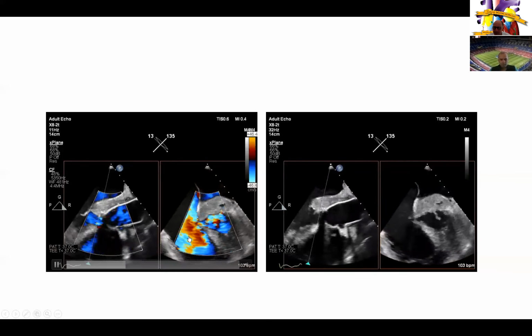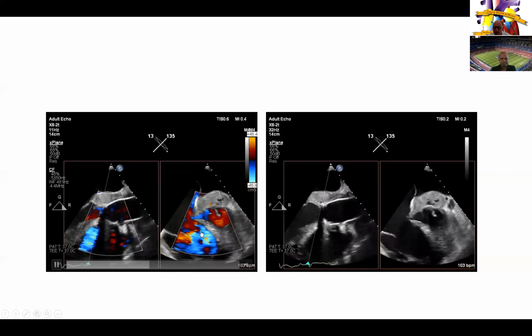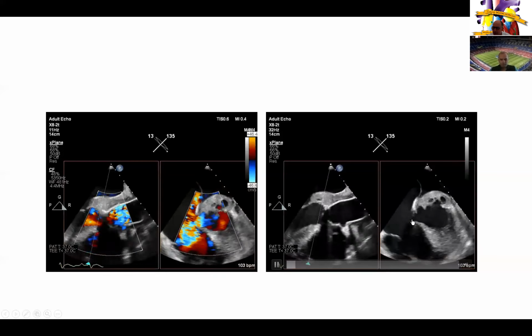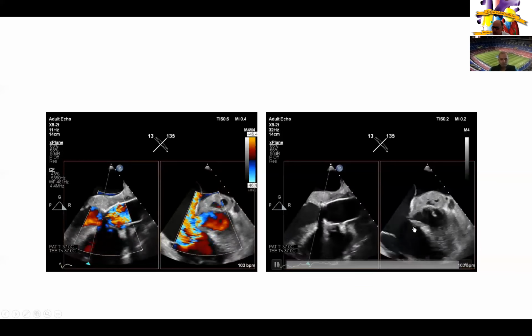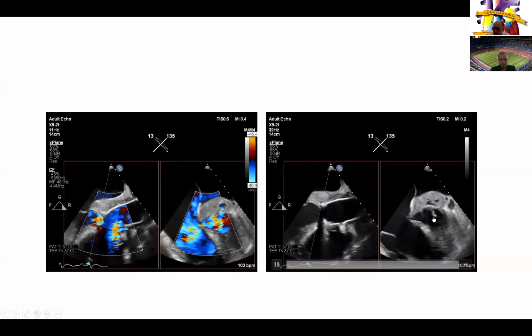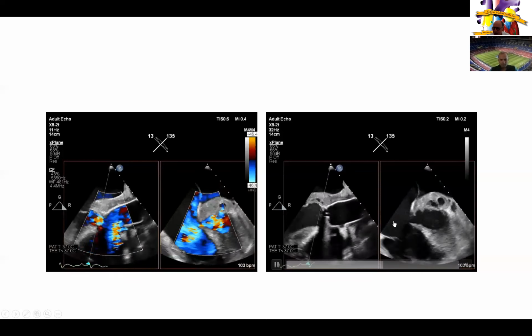And that is clear now why we couldn't appreciate it, because of the severity of tricuspid regurgitation here. And by 2D without color, you can see even visually that defect itself on the far right images here, a defect right from the left ventricular outflow tract, where you can also see some shaggy vegetation into the right atrium.